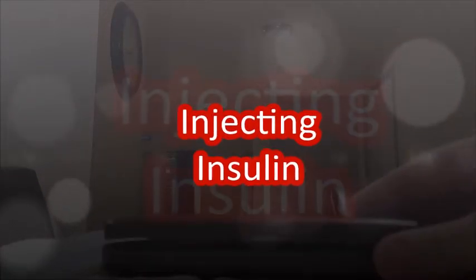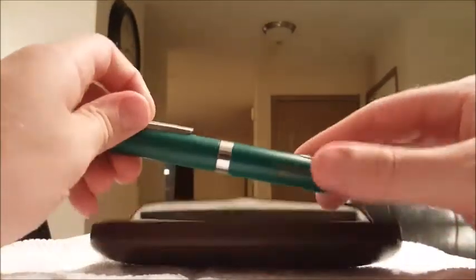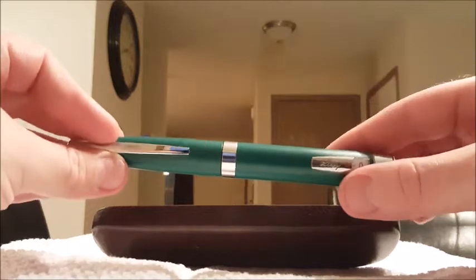This video shows how to give Audrey insulin. This is the pen that contains the insulin.